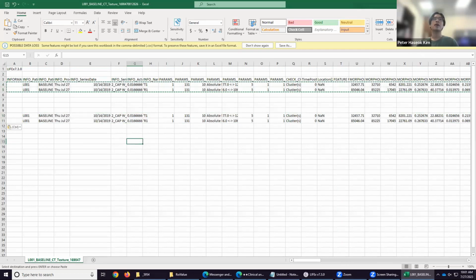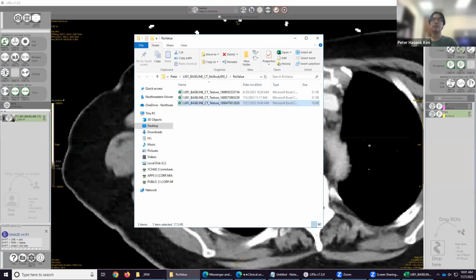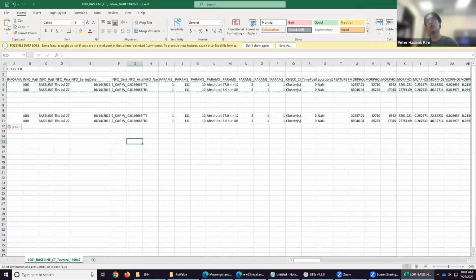Other than that, you want to save all of the work you did also on some collaborative OneDrive, so that when there is a mistake, you know where to pinpoint it and how to correct it.